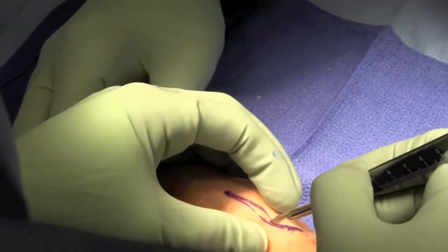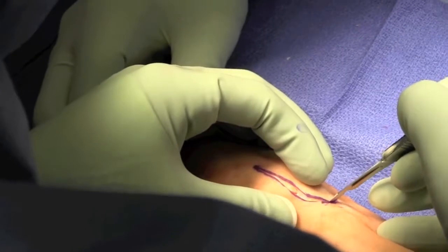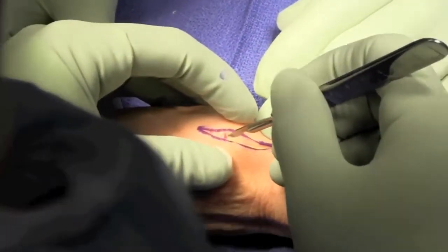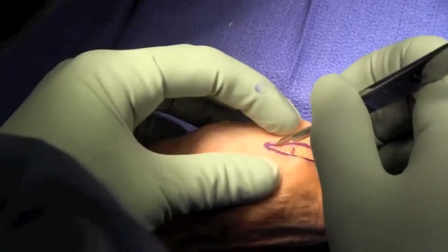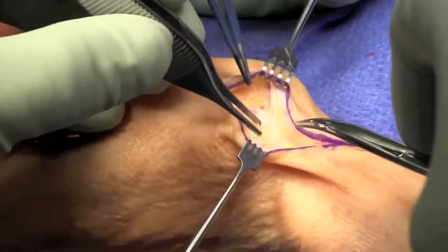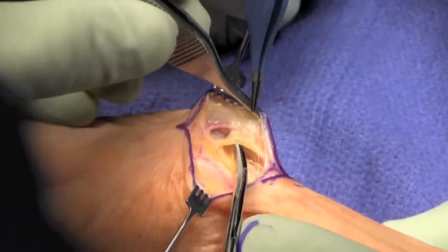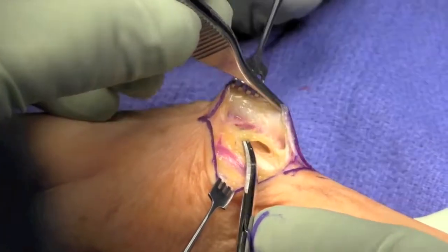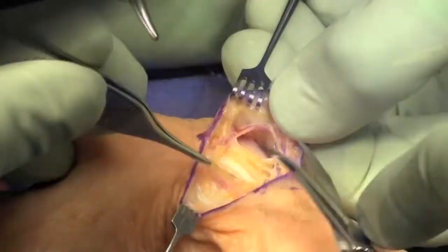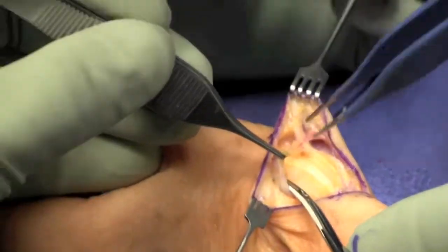Skin is opened and care is made to not injure the radial sensory branches of the nerve. The extensor pollicis brevis and the abductor pollicis longus are identified, and entry is made between these two tendons.